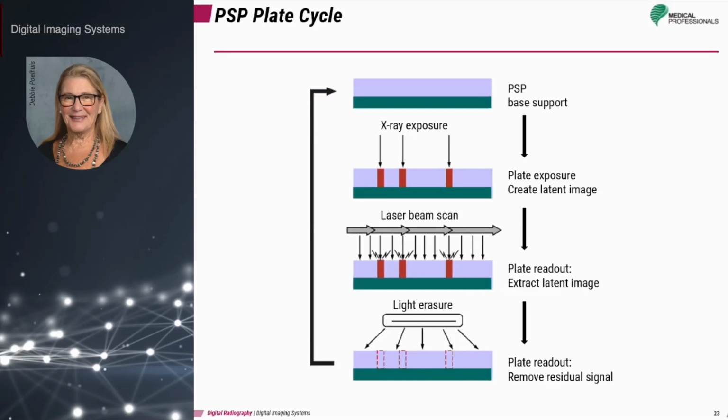Once used for a patient exam, the plate should be scanned immediately or as soon as possible, because it will begin to lose some of the energy that's stored, which is actually the image data. It is estimated that the plate will then lose approximately 25% of the latent image in about 8 hours.